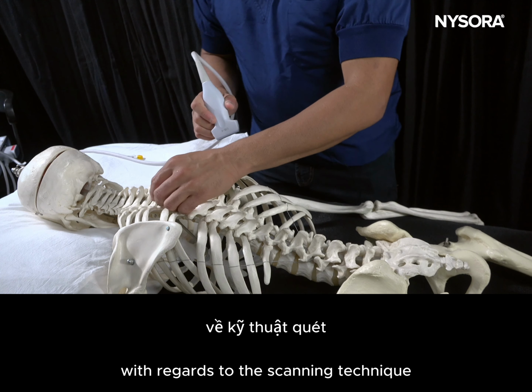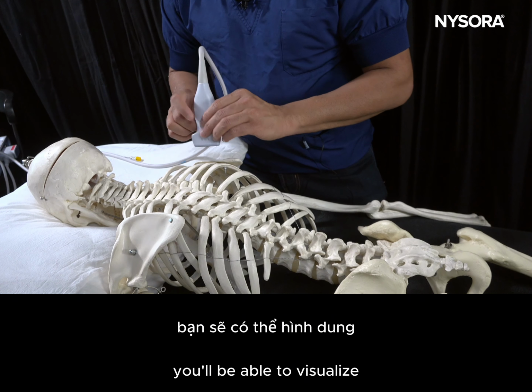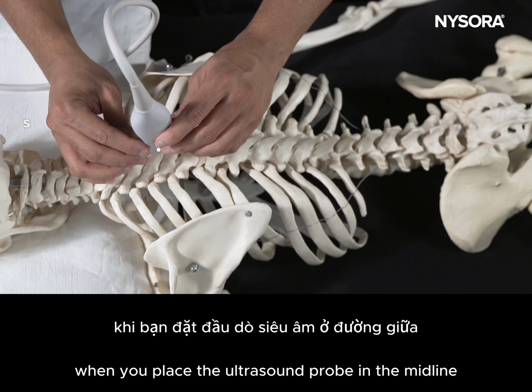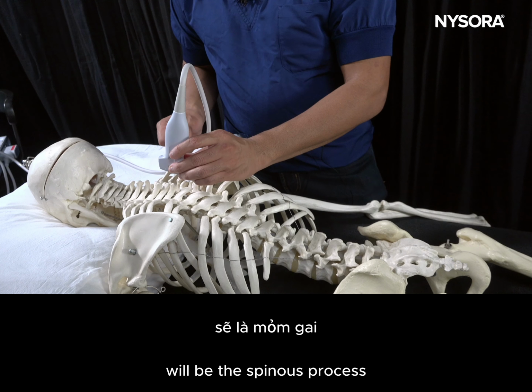With regards to the scanning technique for the thoracic vertebra, there are multiple structures you will be able to visualize, and that's why the skeletal anatomy is important. When you place the ultrasound probe in the midline, the structure that you'll be able to visualize will be the spinous process.